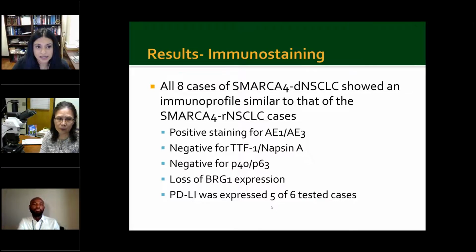So Dr. Shi, in my lab, we don't have a BRG1 immunostain. What would you recommend for pathologists that are listening that don't have a BRG1 in their lab? Our institution luckily has this antibody, and it is commercially available, and the stain is a nuclear stain that's reliable. Also, internal control can be really good if you encounter BRG1 loss cases. So anything from Dr. Lin, your institution?